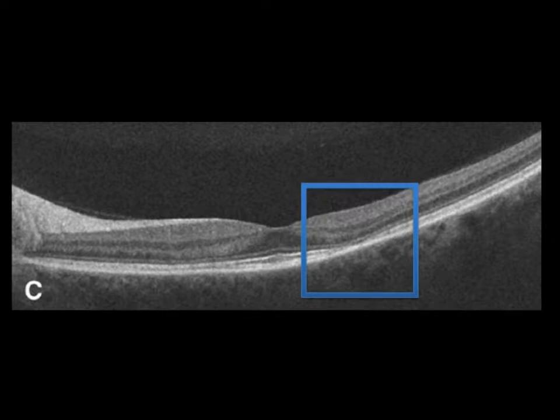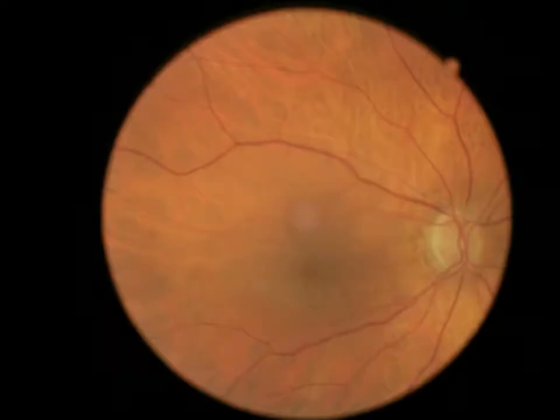So those are things where you'll actually catch early signs of Plaquenil toxicity prior to fundus photos, prior to even sometimes visual field inspection with the 10-2. So this has changed the way we're managing our Plaquenil patients. Another way that we've changed the way we're managing certain individuals is those that we're identifying as having epiretinal membranes. And much of the reason for that is because they're very, very difficult to detect without OCT technology.